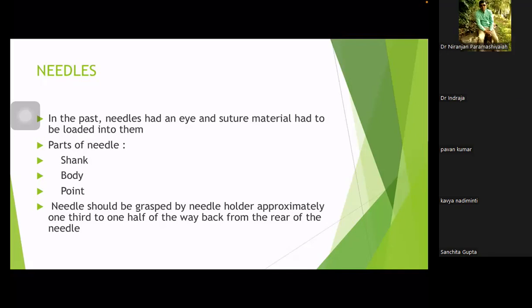I think whatever the situation, the recommendation is that you use delayed absorbable sutures for abdominal wall closure. I don't think there are any particular circumstances where you should use either nylon or polypropylene instead of PDS.